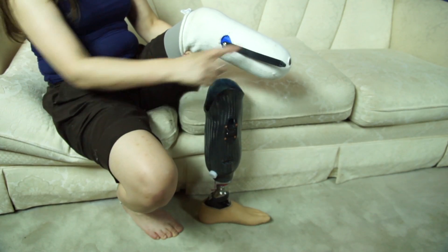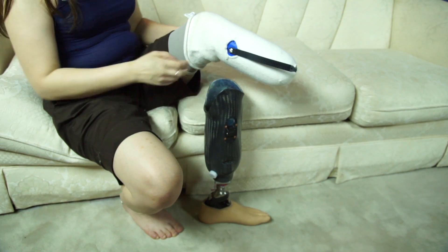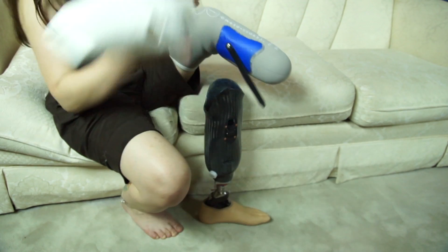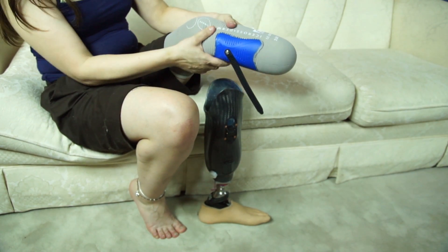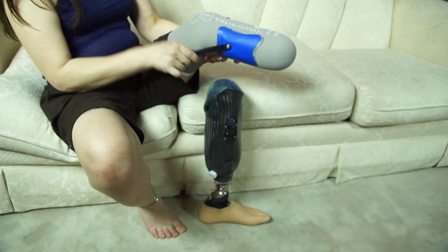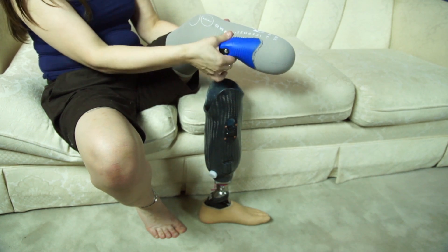Without my socket on, you can see that there's this ratchet strap attached to my leg. This is a liner that fits over my residual limb, and the ratchet strap is glued on via this blue silicone flexible pad.